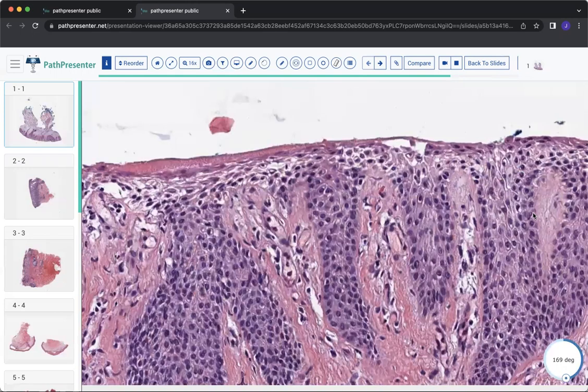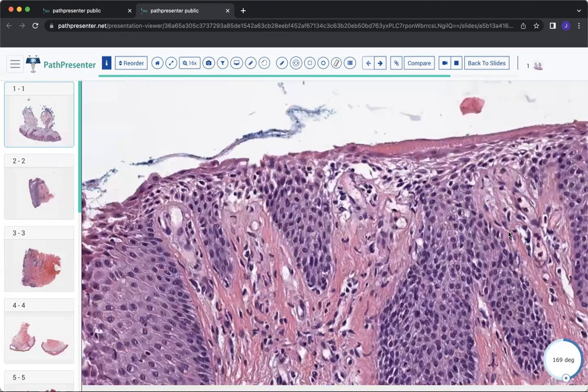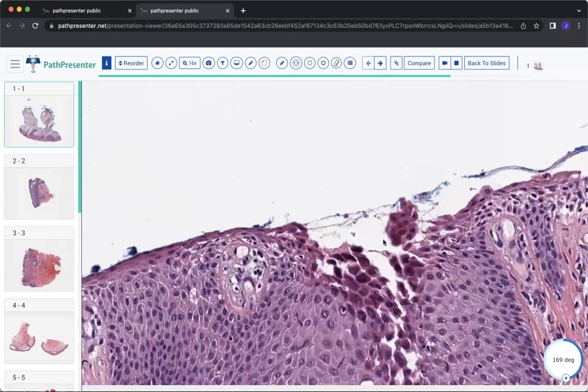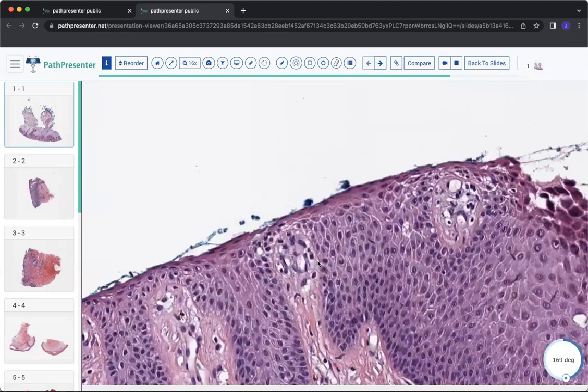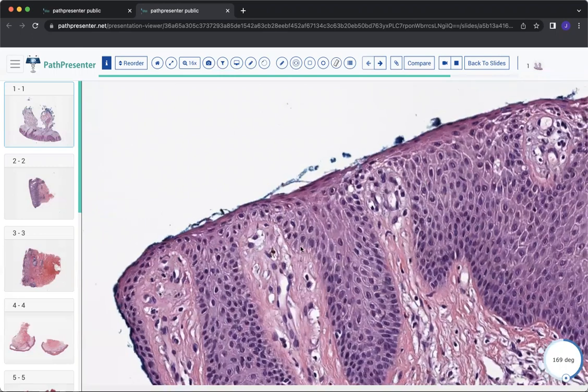Sometimes even bullous impetigo can look like this, but you're going to usually see more bacterial organisms in the bulla space, because in bullous impetigo you're going to have a lot of bacteria. But in staph scalded skin, unfortunately, you don't have that much bacteria. In fact, it's a toxin-mediated process, and the toxin actually inhibits desmoglein 1.